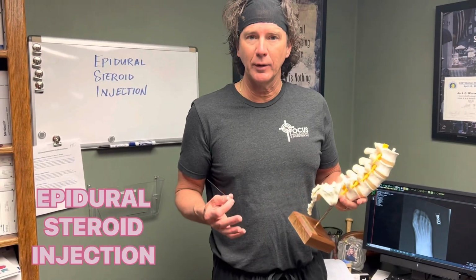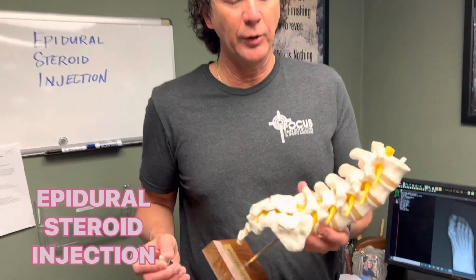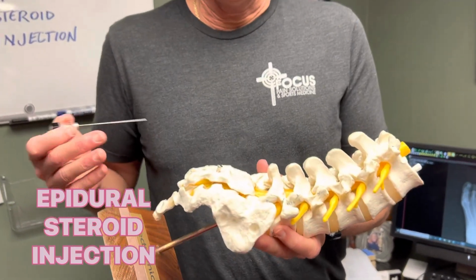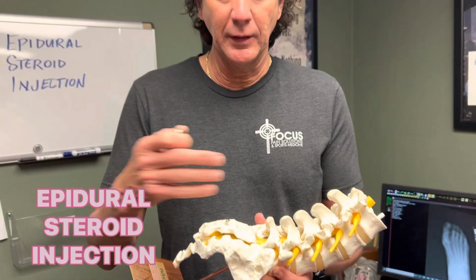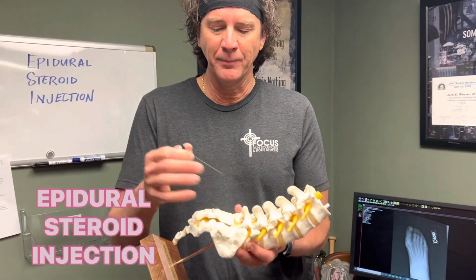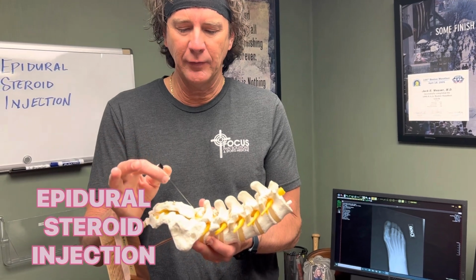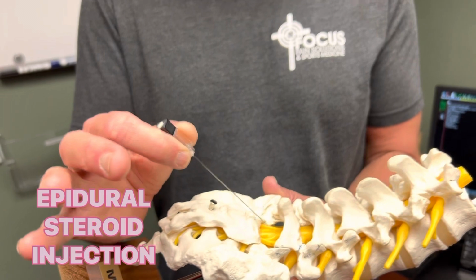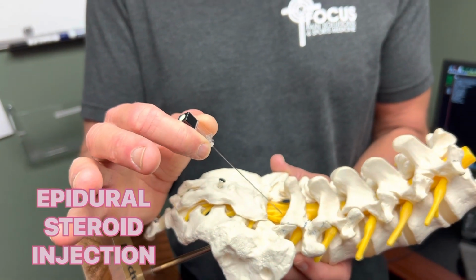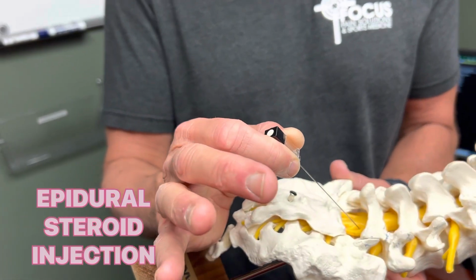We're putting steroid medicine into the space where the disc is. Basically, we're taking an x-ray machine. The patient's laying on their stomach. We're using an x-ray machine to visualize the bony anatomy, and then we guide a needle down into the space where the disc is. There's a ligament at the very end of this space here. Once we get through that ligament, we're in an open space and we inject steroids right on the space where the disc and the nerve is.